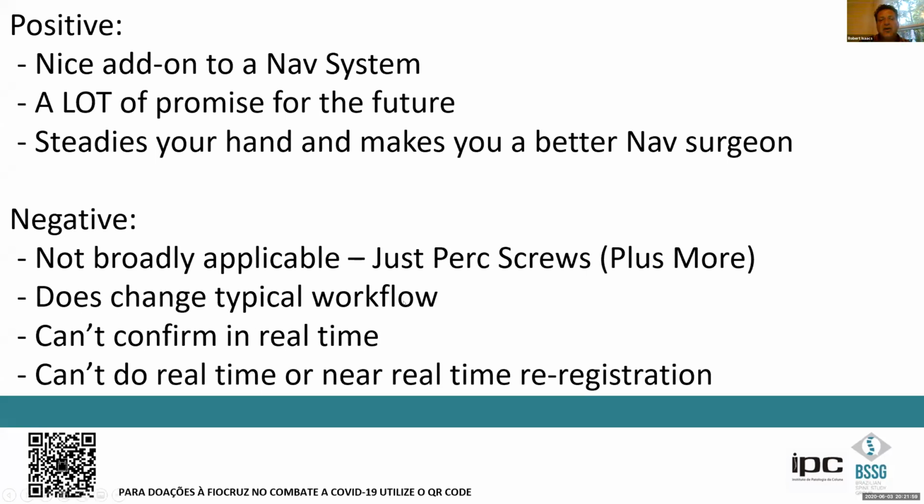Do they change your workflow? Probably they do substantially. Is there an issue with no real-time confirmation? I would argue there is. And there needs to be the ability to re-register. For example, the last case I showed, the deformity case. They do that, they fix some of these issues. These things are going to become essentially standard of care at some point in the future.